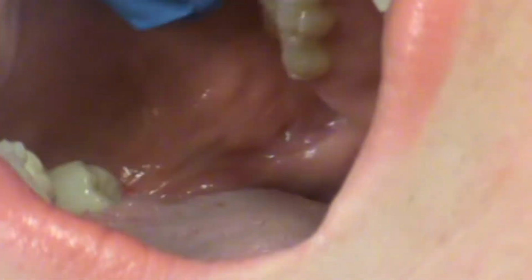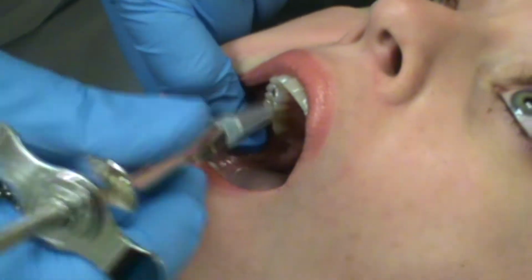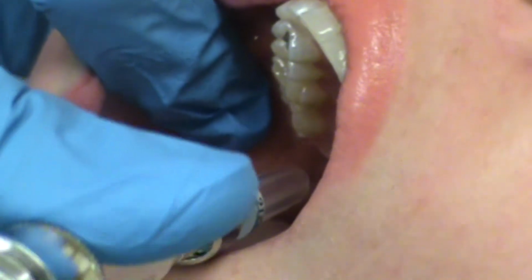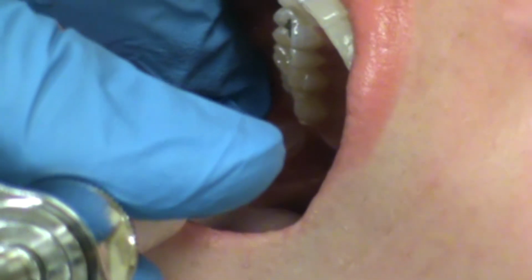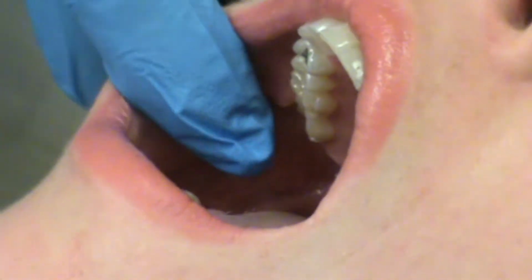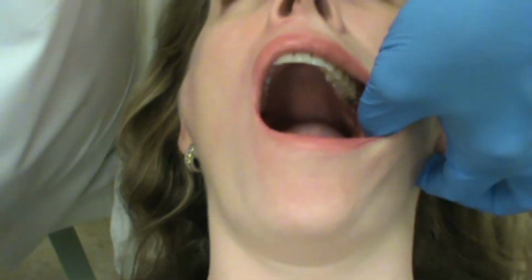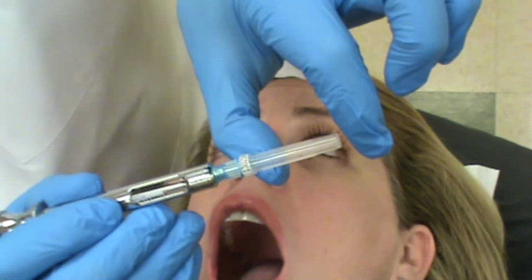And because I can feel that her ramus flares out a little bit, not too much, we could come in slightly over by the premolars on the opposite side, drop it right in, and about 2/3 to 3/4 of the depth of the needle is where we stop and deposit once we touch bone. And we can estimate that depth just by knowing how deep the needle is, but also if you take a look here, I'm grabbing the back of the vertical aspect of the ramus and the coronoid notch, and then I can feel it's about this big. So you know the tissue kind of hangs in front of the bone a little bit. You're going to need to go back about 3/4 of that distance.